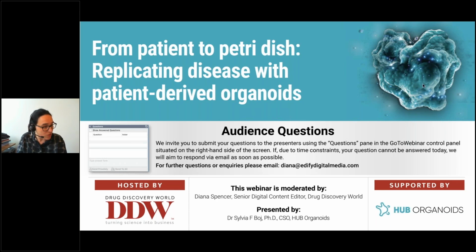When you do a resection of colorectal cancer or pancreatic cancer, you can get this full plate in around 5-7 weeks. And if you try this from a biopsy of, for example, colorectal metastasis in liver, you can make this full plate in around 10 to 12 weeks.